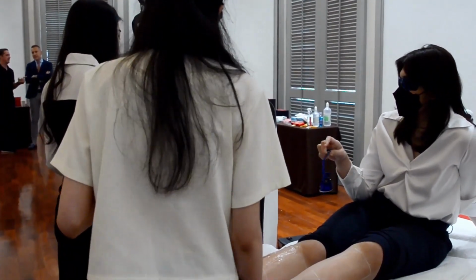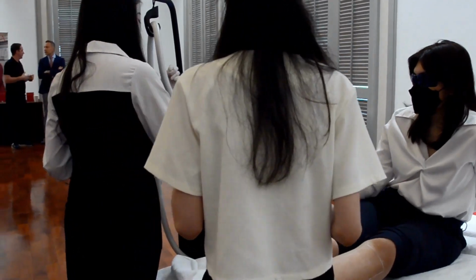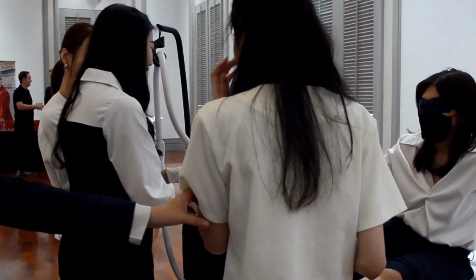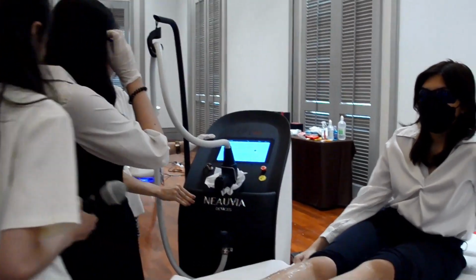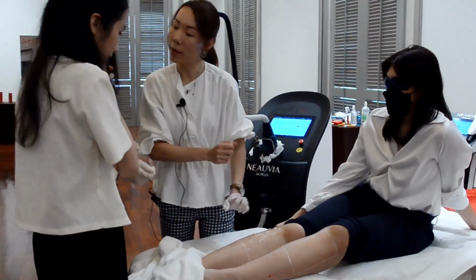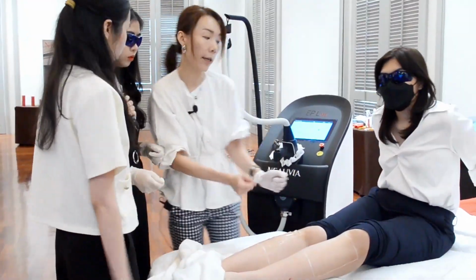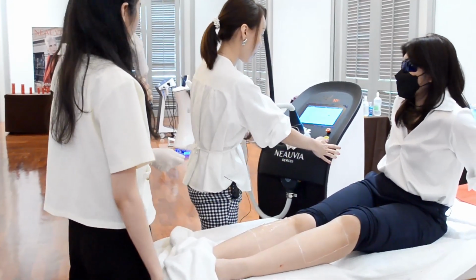Yeah, so you've got to put on the goggles. No, put on the goggles first. And what you need to do is, when you hold the handpiece, don't start the button first. Just get your motion familiar, okay? Get yourself familiar with the motion.